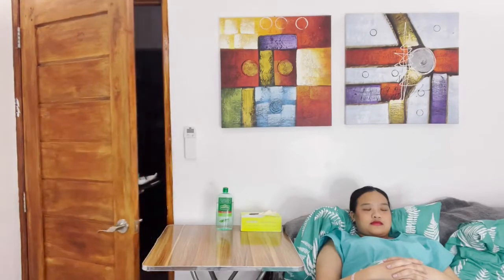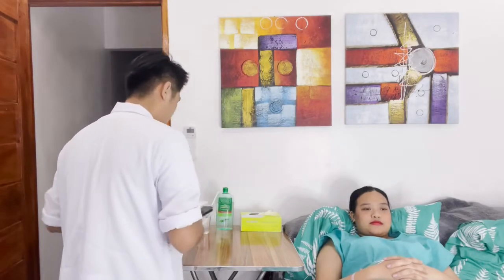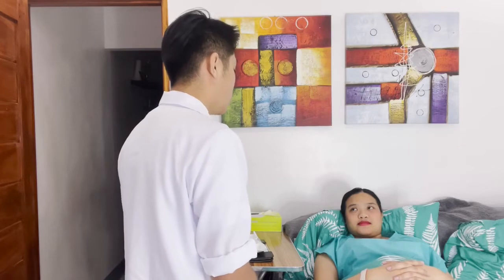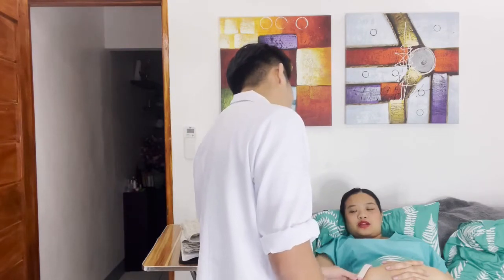Implementation: introduce self and verify the client's identity using agency protocol. Explain to the client what you're going to do. Good morning, ma'am. I'm Mark Benjan Abes from NAST and I will be your student nurse for today. May I know, ma'am, your name and your date of birth? Ana Maria Lilio, June 14, 2001. Okay, ma'am.